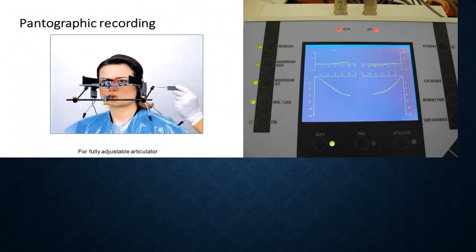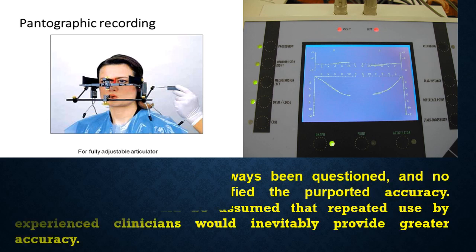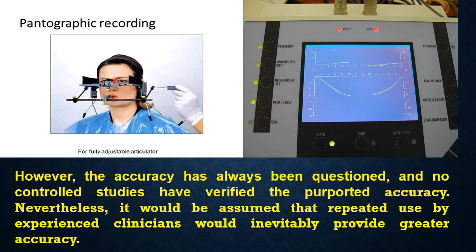Well, in a stage of using complicated instruments, there is the digital pantographic recording. It will trace the mandible computerized on the screen. This is just for your knowledge. However, the accuracy has always been questioned, and no controlled studies have verified the accuracy. However, it would be assumed that repeated use by an experienced clinician would inevitably provide greater accuracy. As I said, it is a very complicated instrument, and any error in any step will complicate the whole procedure.